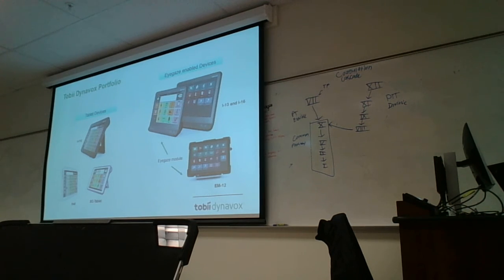Is the EM12 funded? Yep, the EM12 is a funded device as well. And the Indie, I saw that was discontinued as a funded device. Exactly. So the Indie now, on the bottom left, you can just directly purchase off of our website. The Indie 7, which is a smaller version of that, is still funded. So that one is at least still funded.